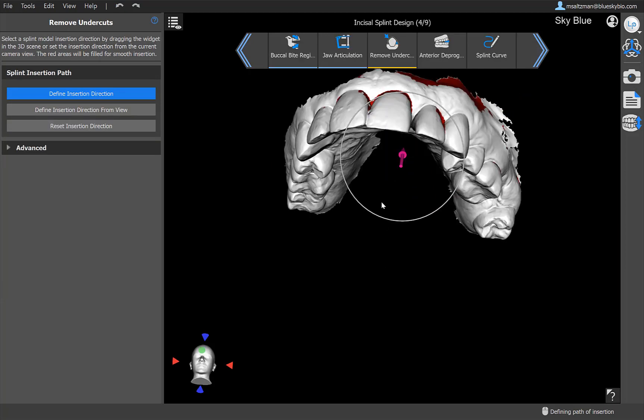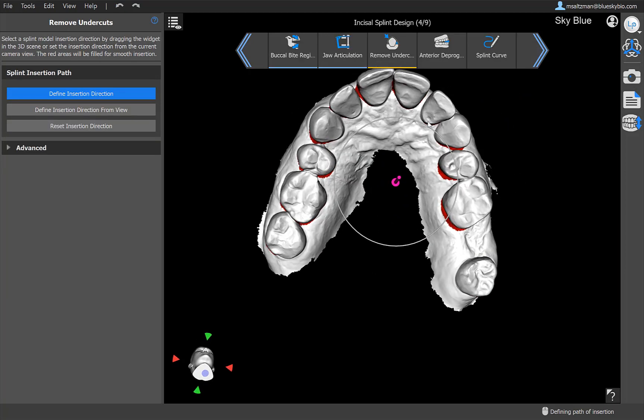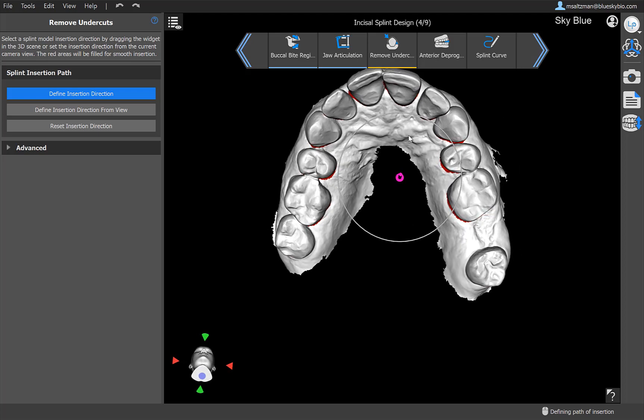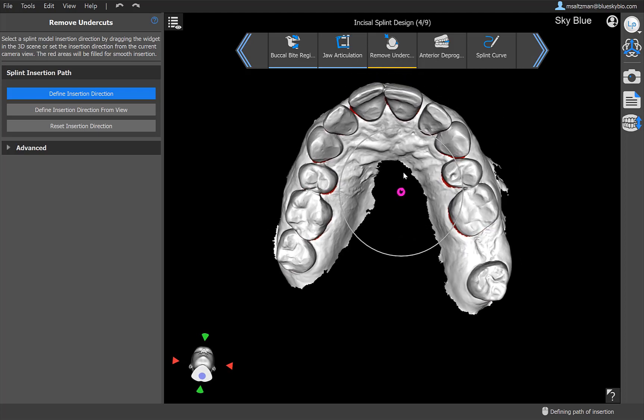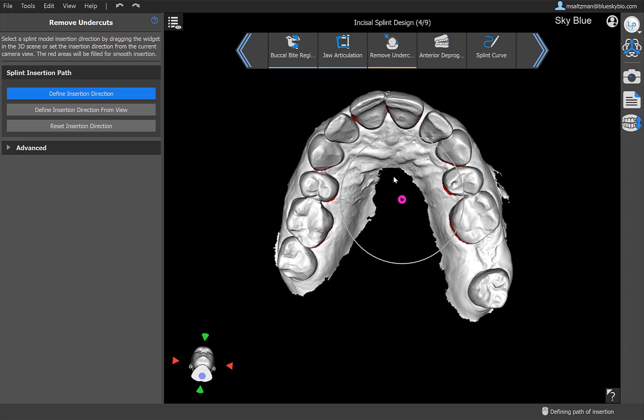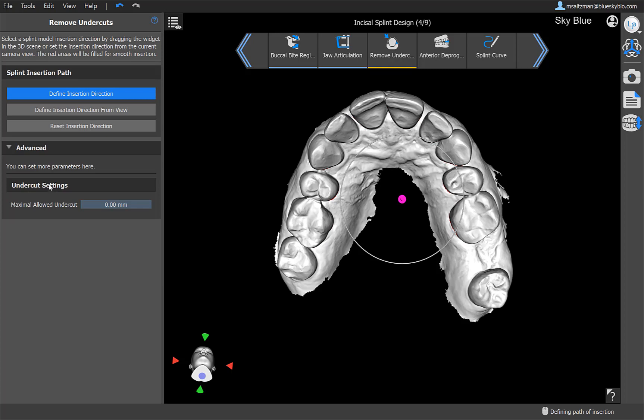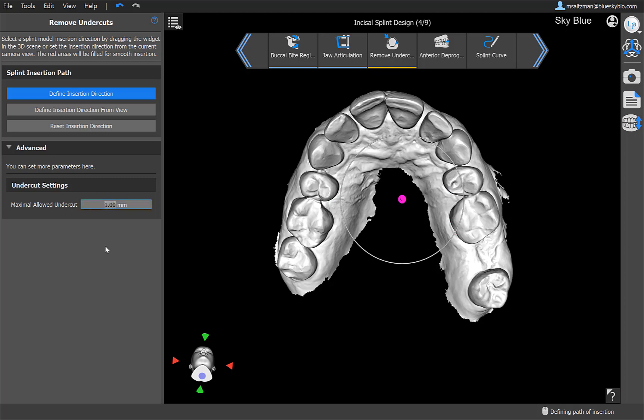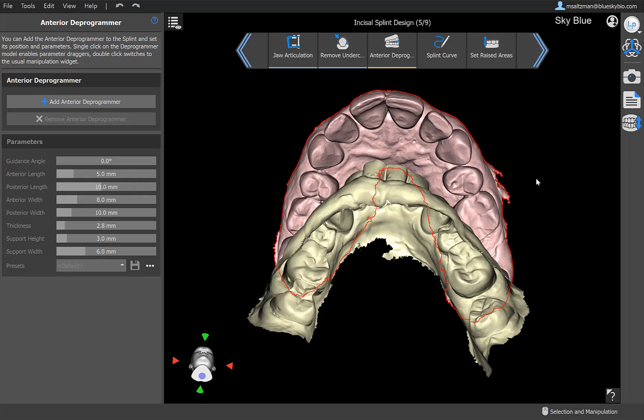Define insertion direction. Let's go ahead and define insertion direction from the view. Here we have undercut settings, maximum allowed undercuts. So we could go ahead and increase that. And all of these values, by the way, you can now use the arrows, you can now grab and drag, you could also just click on the value and just enter the desired value that you would like to put in. Click next.